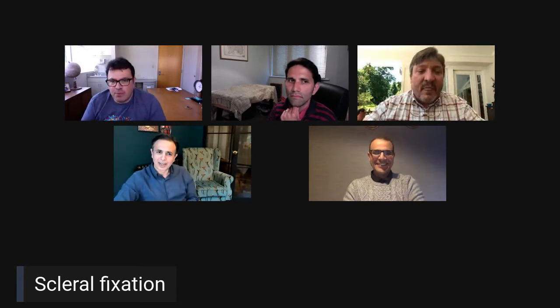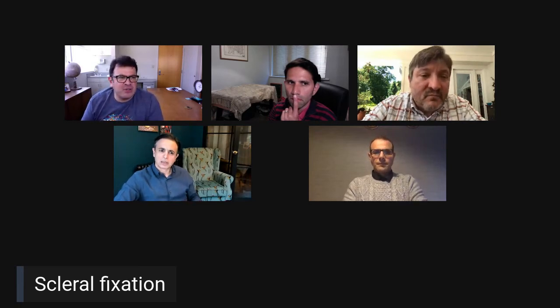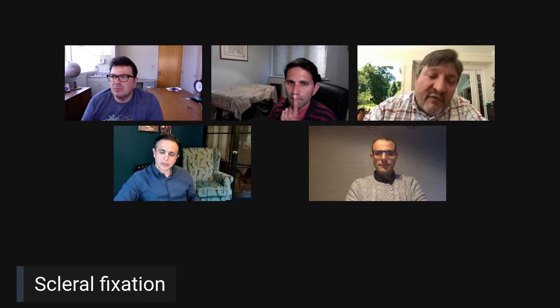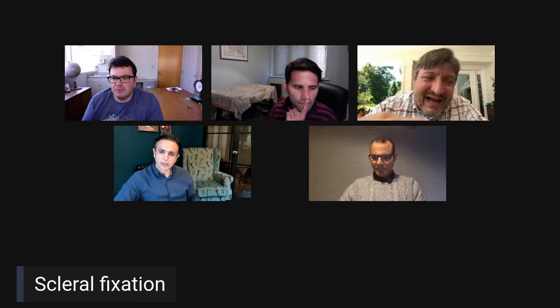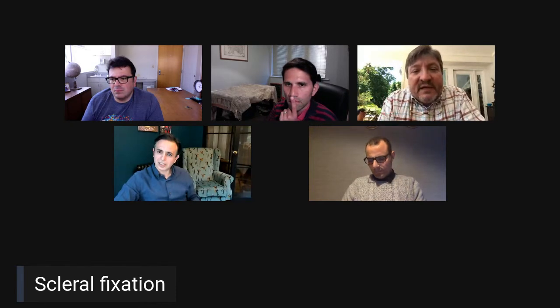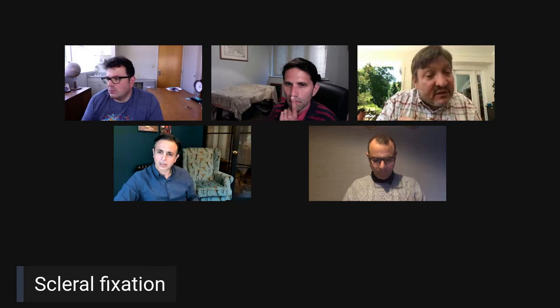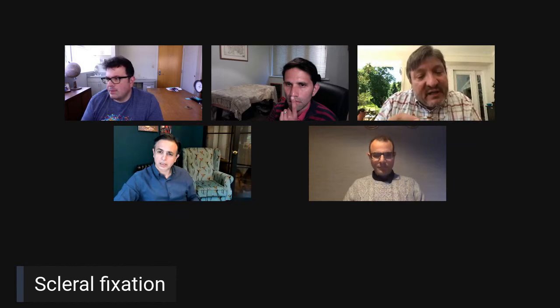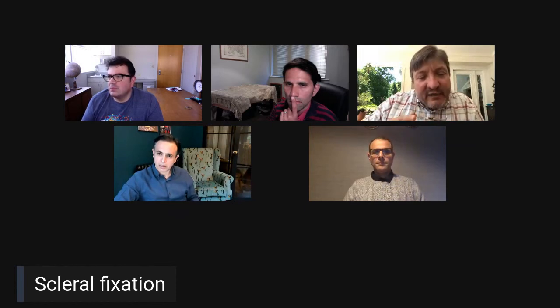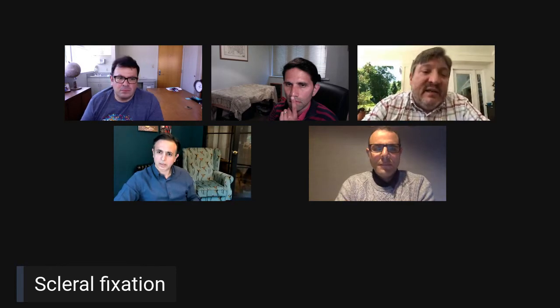And it might be best to hold from the knot, right, Chris? Because that's really the advice, always to try to hold from the knot or from the ends of the knot rather than the main suture itself. That's how they handle it in cardiac surgery. Right, yes. And you have to be careful because when you hold a big knot, the jaws of the forceps don't completely close and there's a gap that makes it hard to pass through the sclerotomy. So you're actually better cutting the tails a little bit long and grabbing just the tail. Yeah, and using the tails to dunk the knot into the eye.